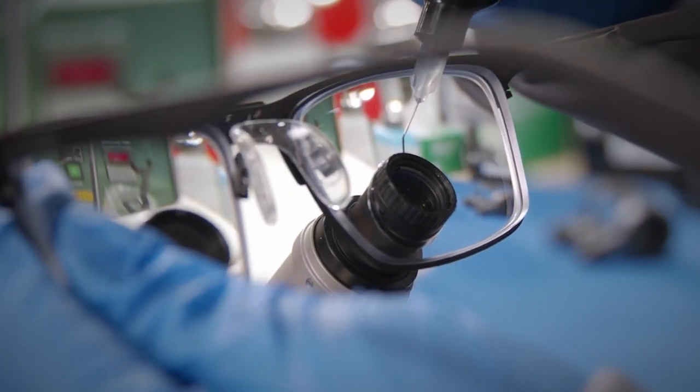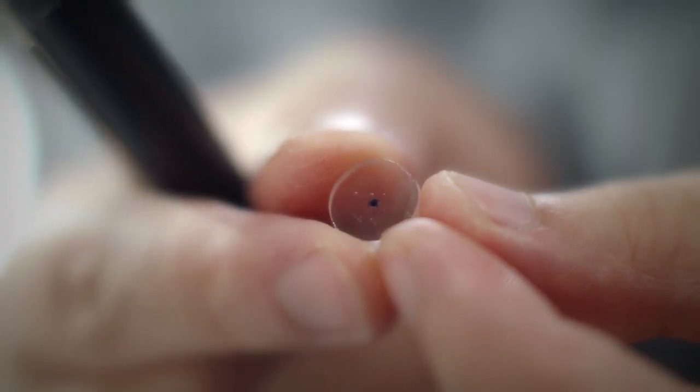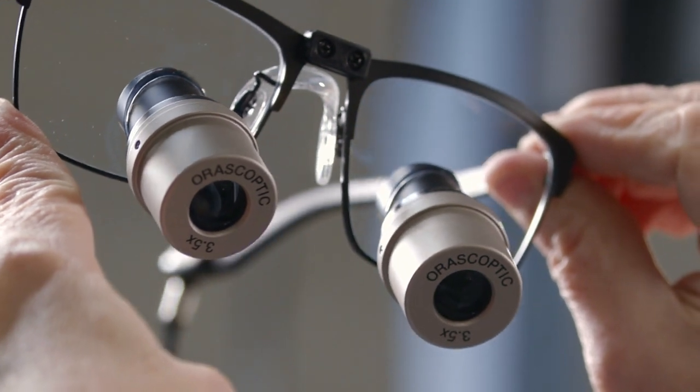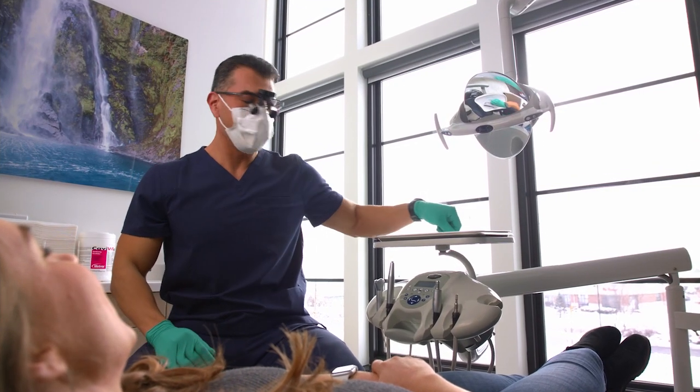Because every pair is built to your specifications and expertly calibrated to fit your face, your prescription, and the unique vision demands of your practice.